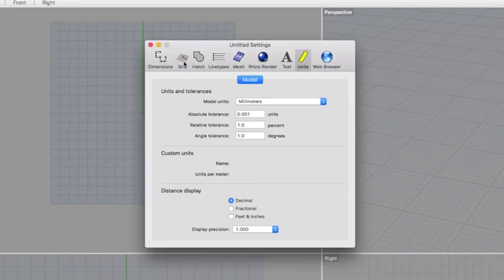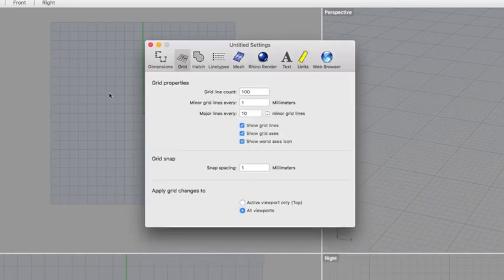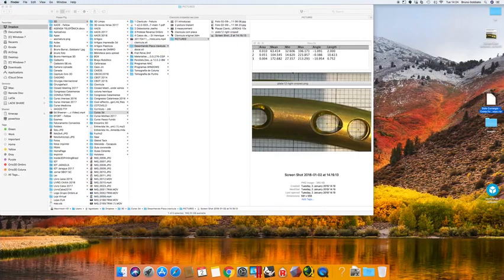And now we know that every small square is 1 millimeter, just like our scale paper. We know for sure that our implant has 10.6 centimeters or 106 millimeters. So this dimension here is 106 millimeters.